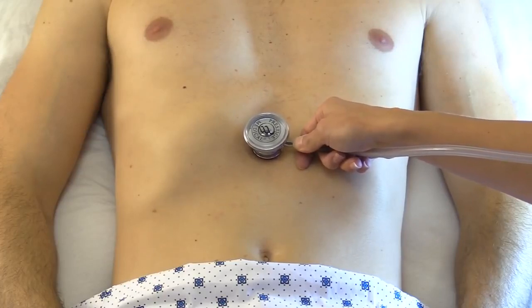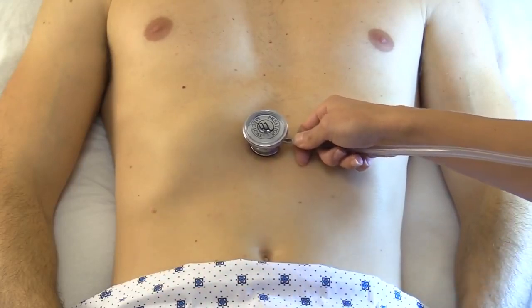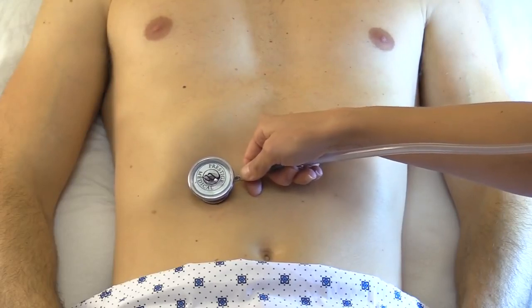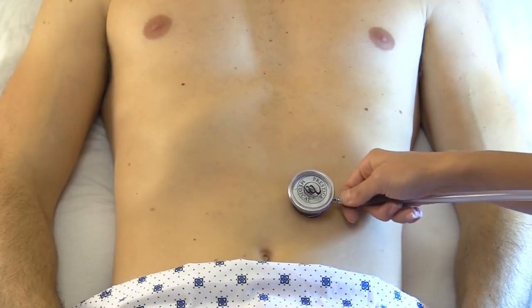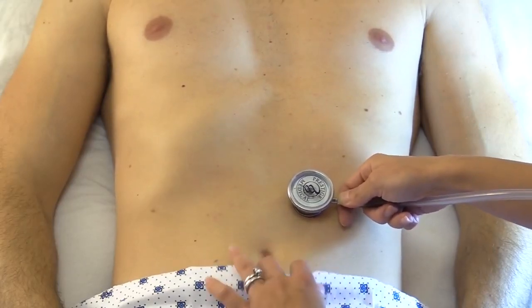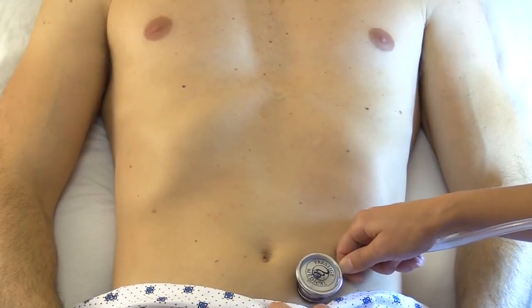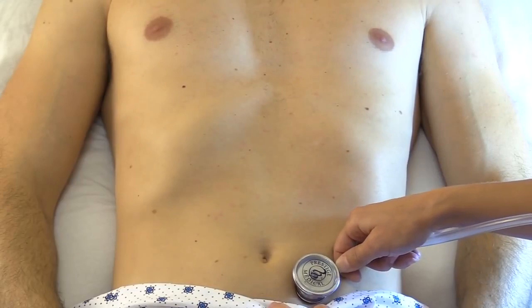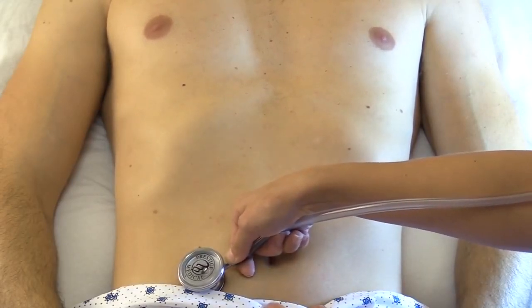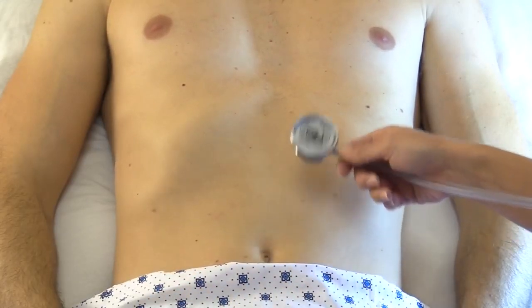Then we're going to listen at the right and left renal arteries, which is a little bit down from the aorta location. So here's the right. Okay, none noted, and then over the left. Then we're going to listen at the iliac, which is a little bit below the belly button, right here. And this is the iliac artery. And then listen on the other side. And again, like I pointed out, you could listen at the femoral artery in the groin if you needed to.